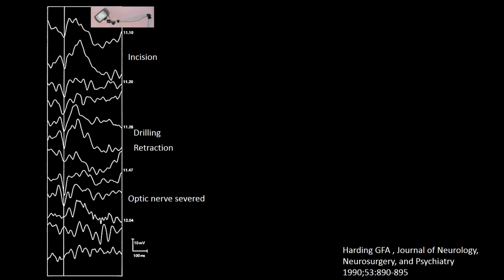The visual evoked potentials in this frame were obtained during surgery using a stimulator called Aston stimulator. For our purpose, we can consider it as a lamp stimulator. Notice the time legend. As you can see, pointed by the arrow, the surgery was aimed to remove the optic nerve.